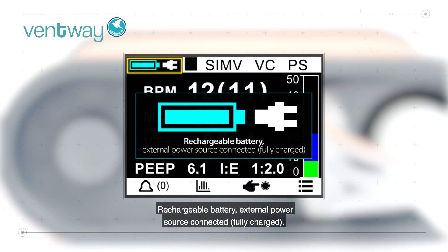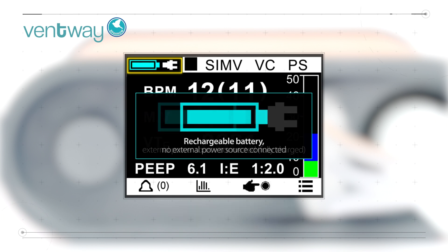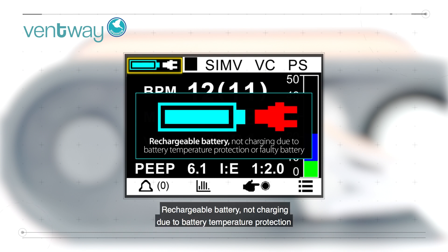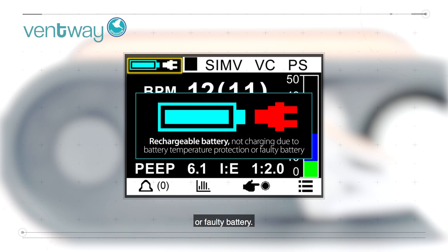Rechargeable battery, external power source connected, fully charged. Rechargeable battery, no external power source connected. Rechargeable battery, not charging due to battery temperature protection or faulty battery.